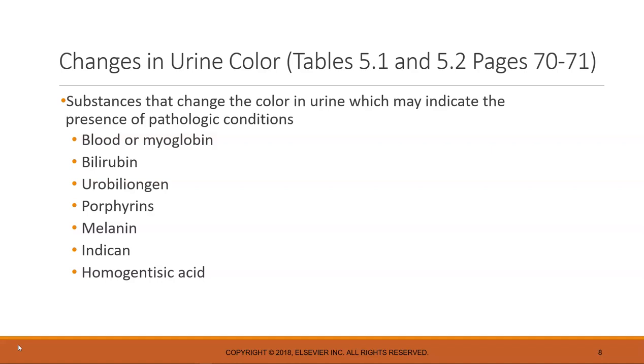And one caution about amber-colored urine. Be sure, of course, that you're always wearing gloves, but before you do chemical testing, you need to swirl it and make sure all the elements are suspended in the urine. You will notice that the yellow color will coat the sides of the urine container. Usually this indicates that the patient has hepatitis. Now, there are many kinds of hepatitis, but again, I handle these with even more extreme caution.